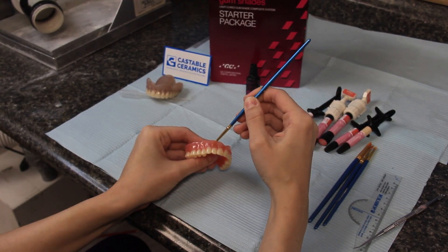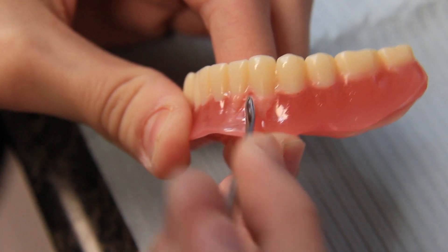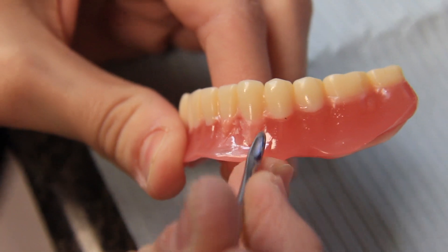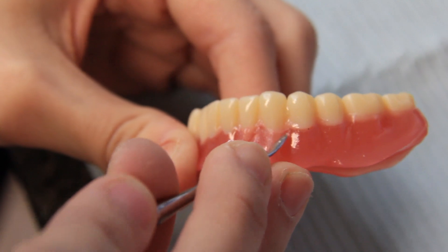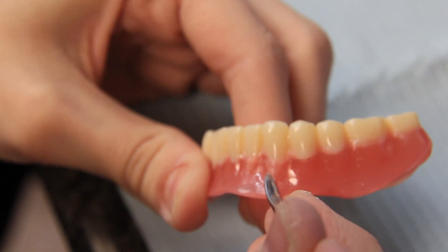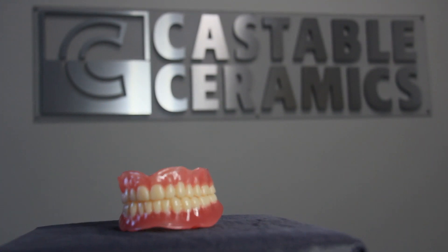A technician uses composites and stains to emulate natural features. This process is called characterization. Characterization is optional, but it goes a long way towards making the dentures look and feel more lifelike and natural. Thanks to modern technology, dentures can really be something to smile about.